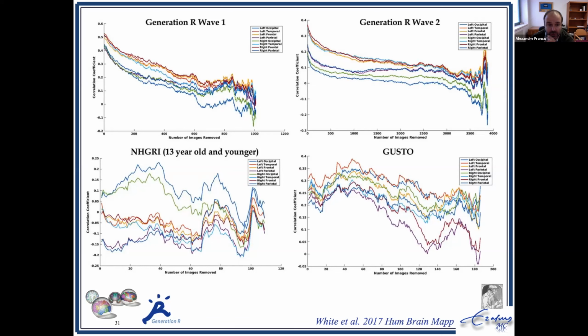But what I'm really liking here, Tonya, that you're showing us, is that even though you're being very exclusive and picking very good participants, when you exclude say 400 participants, FreeSurfer cortical thickness is still showing a correlation with your measurement of quality. For me, that says FreeSurfer is still very sensitive to the quality of the data. Even though your measurement is looking from outside, you still see some relationship. And that's why you plateau around 0.2. Yeah.